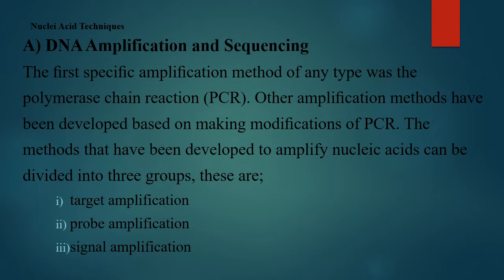Now, there are different methods that have been developed to amplify nucleic acids, and we can break these down into target amplification, probe amplification, or signal amplification. So these are the three key kinds of nucleic acid amplification that exist.